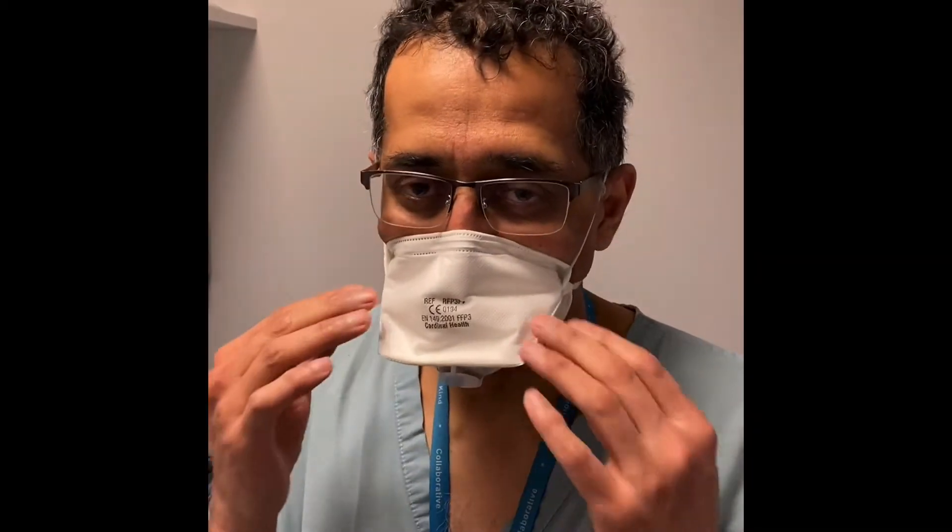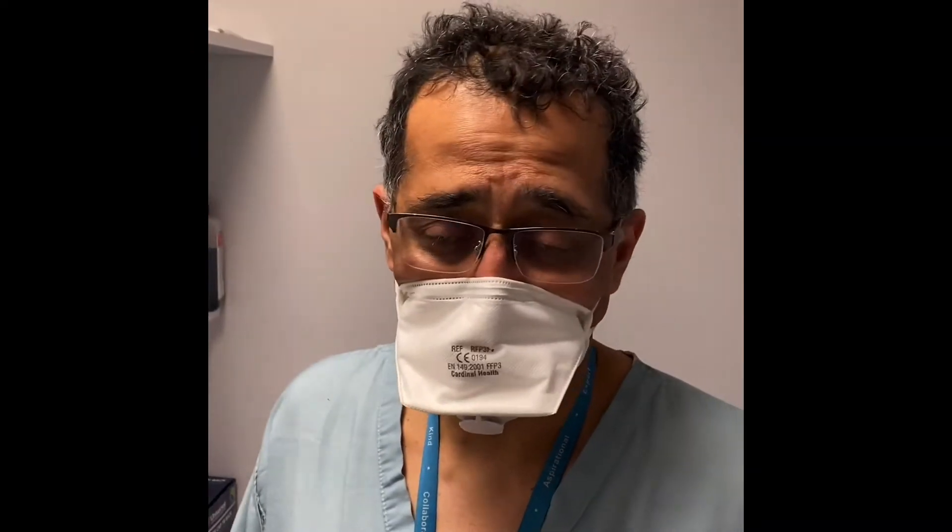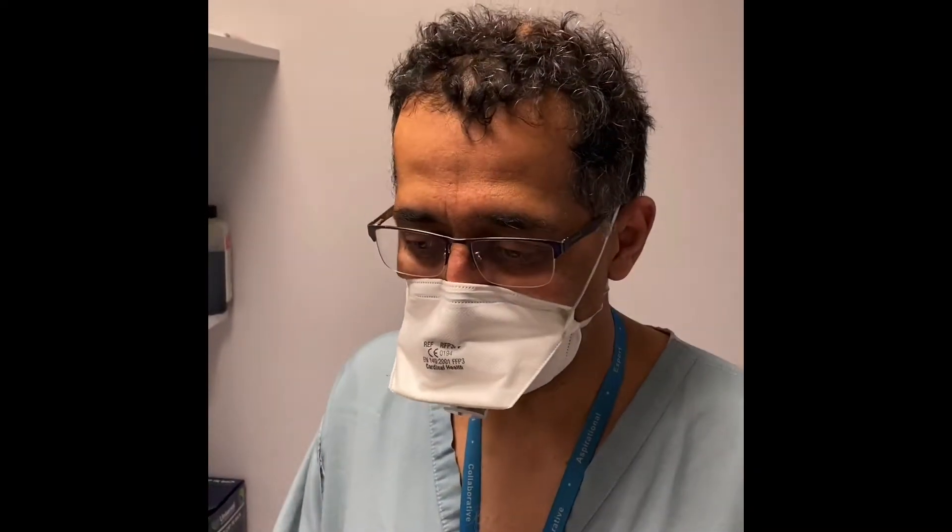This is an FFP3 mask with a filter, but it doesn't fit me properly — I failed the fit test. What I'm going to do is put the Tegaderm on and show you how to do that so that it then passes the fit test, because I've passed the fit test with this method.